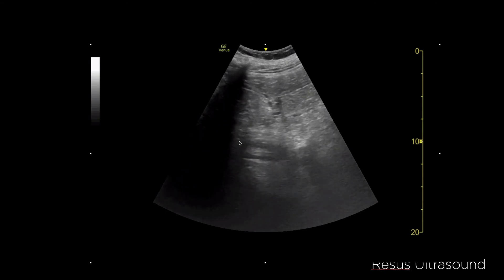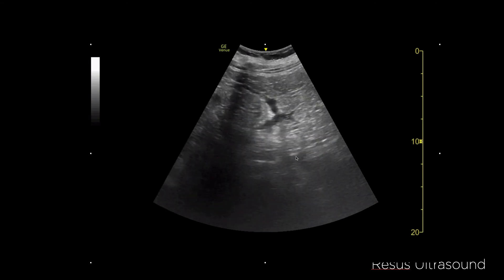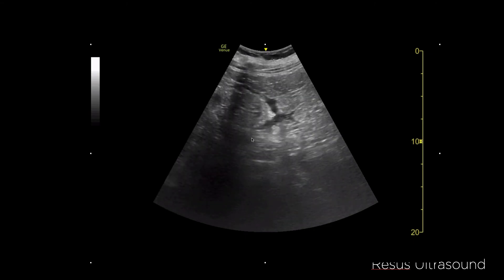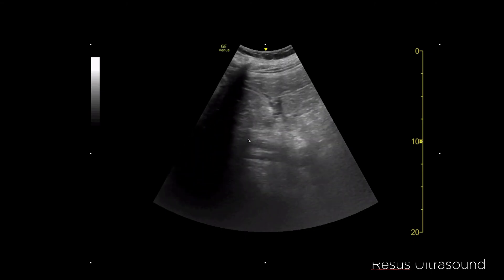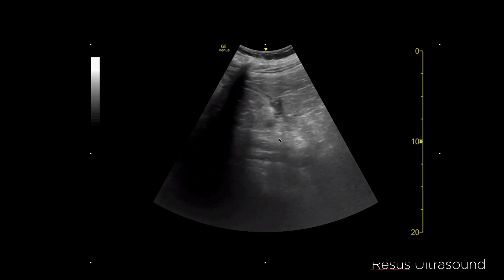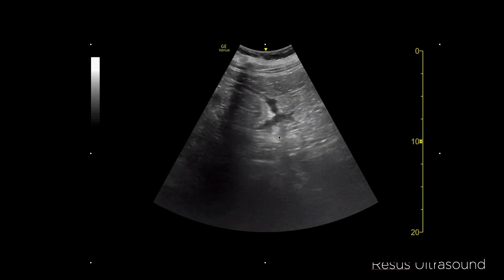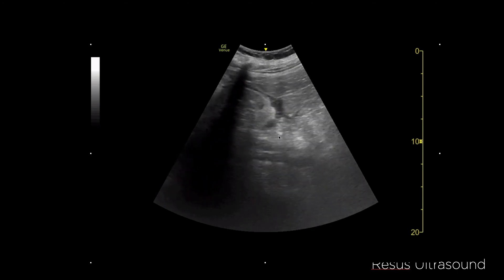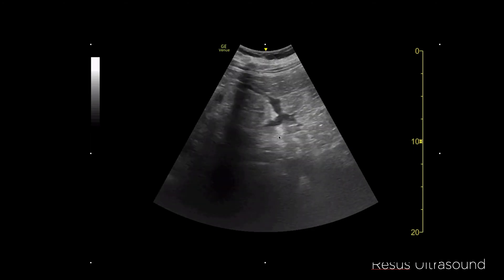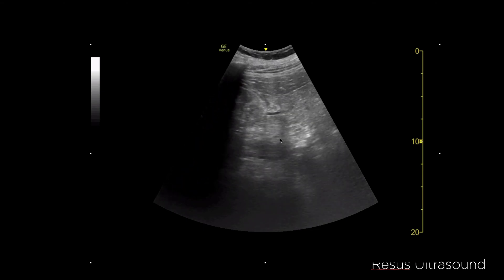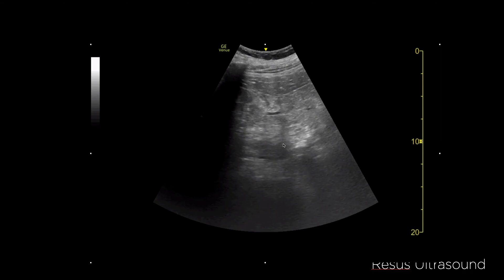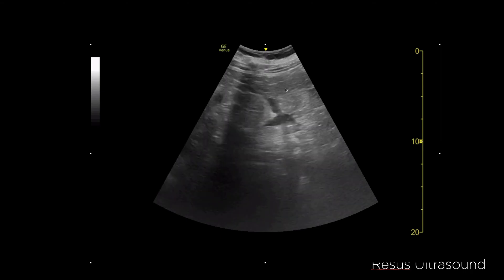Down here is the psoas muscle. Normally, if the patient is healthy, you can see the psoas muscle quite clearly in a striated pattern. But here it's not very clear. On CT scan, this patient has a retroperitoneal hematoma as well, which explains the indistinct psoas appearance.